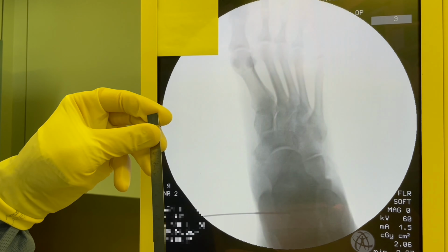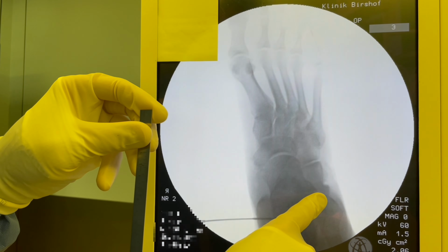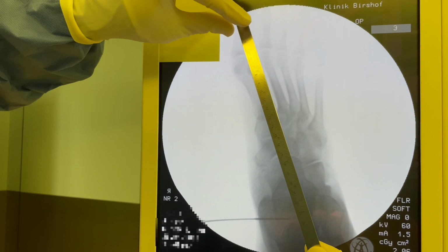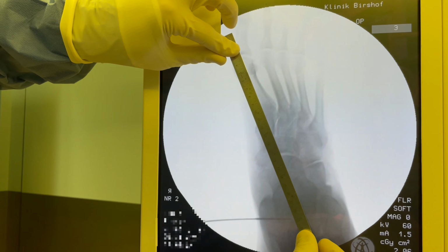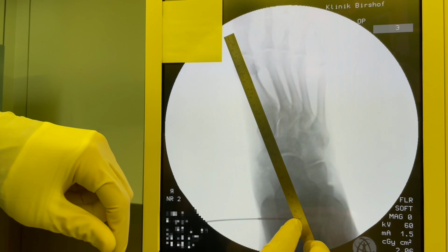During surgery, a ruler can be used to connect on the screen the medial border of the tibial sesamoid and the tip of the K-wire. The center of the talar head should, after correction, be clearly laterally located to the ruler. If not, the correction is not sufficient and additional procedures to correct the deformity should be considered.